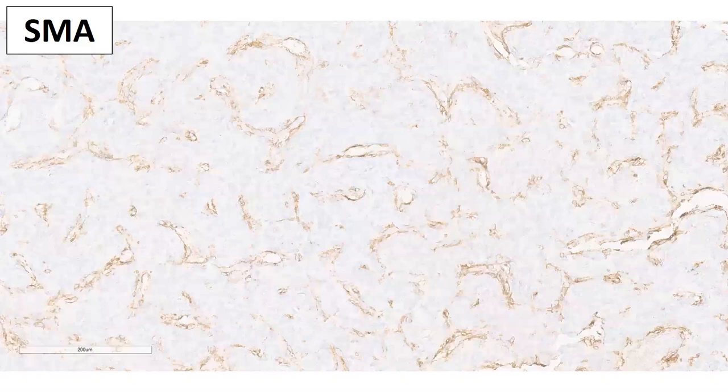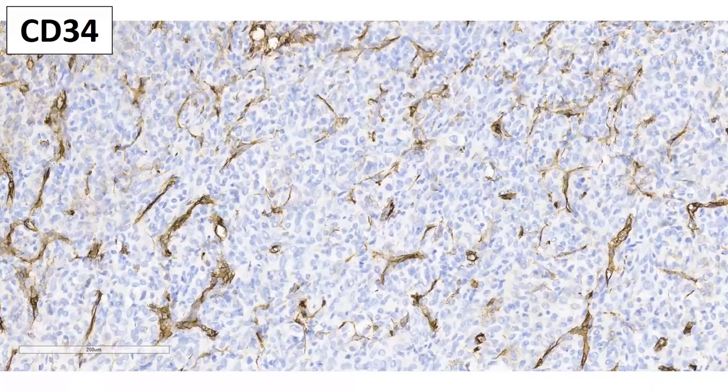And the vascular pattern here, it's highlighted with the smooth muscle actin, is frequently called staghorn. Stag would be the male deer, you know, the antlers and how they branch, right? That staghorn and how they curve. They branch, they also curve. That's the traditional buzzword, if you will, in path lingo for this. And it's these whorls pushing into the vessel, which are creating the curvature of the staghorn vessels. And this is just a little bit higher power. Look, right in the center, you see the sort of whorl, et cetera. You can see exactly the same thing with a CD34, which is highlighting the vasculature here. Shows the same thing.